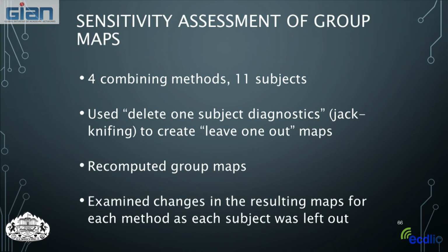So we did this, we recomputed the maps, then we tried to get a quantitative measure of how much one individual subject affected our group results.